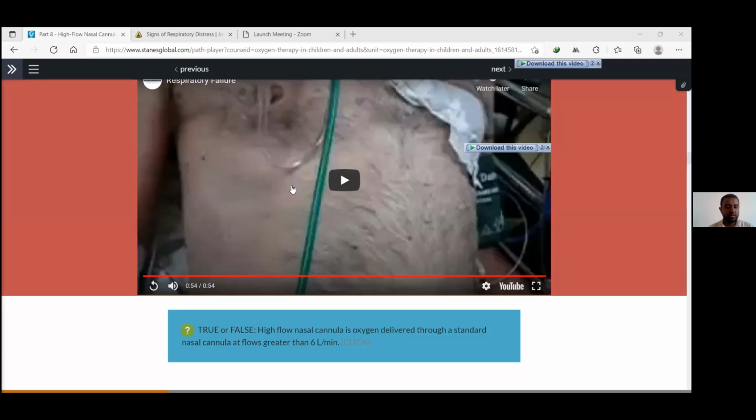Surafil said false, because it can deliver more than 60 liters per minute, not 6 liters. Okay, Idarsal said 4 to 6 liters without humidifier. Jenny said wasting and traumatizing. Okay. So the poll stands at 75% of our participants saying true, and false, 5 people say that.